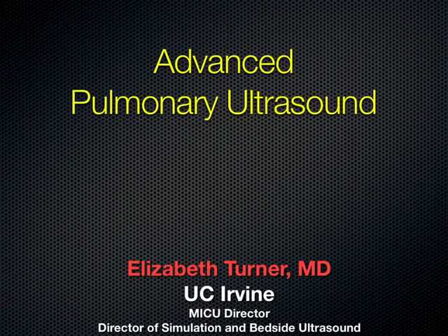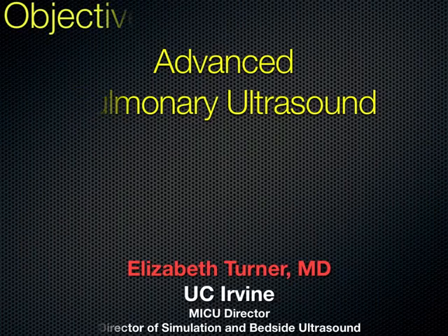Today we're going to talk about advanced pulmonary ultrasound. At this point you should have seen the lecture already on basic pulmonary ultrasound, including pneumothorax, pleural effusions, and pulmonary edema. This talk will expand on that talk and remind you of some of the key points.